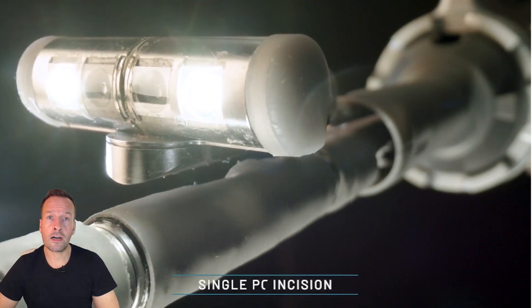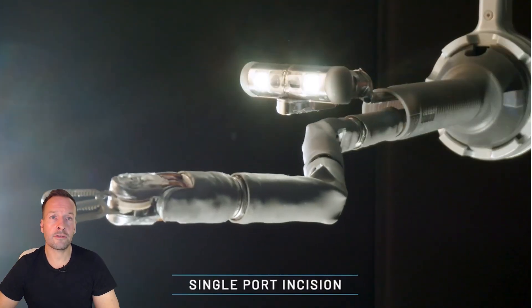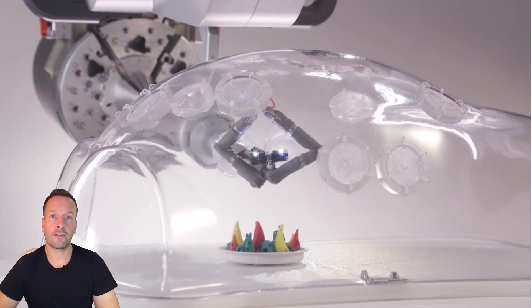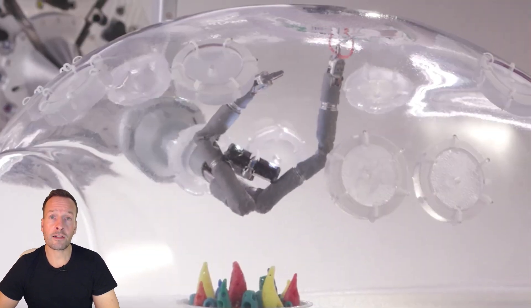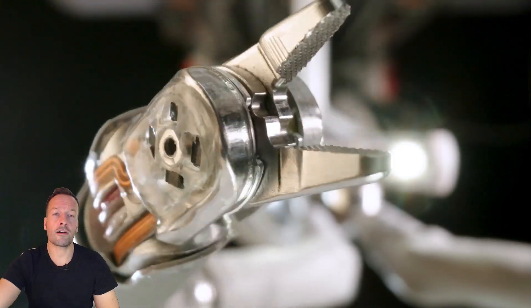Surgeons control the arms from a console using an immersive 3D headset, providing a high-definition view of the surgical field. It's like a high-tech video game, but real lives are at stake.